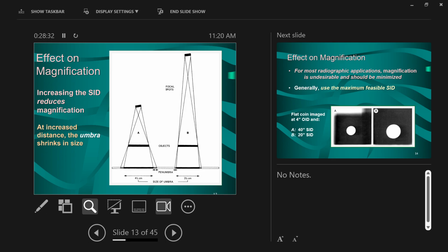The longer your distance, the smaller your umbral shadow; the shorter your distance, the wider your umbral shadow. That is the same exact thing as doing this: long distance, shadow cast in my hand. Short distance, hand gets bigger. The umbral shadow is larger when I'm close and smaller when I'm far away.